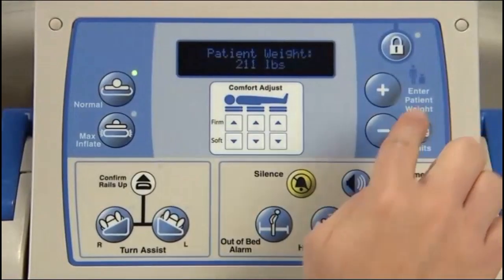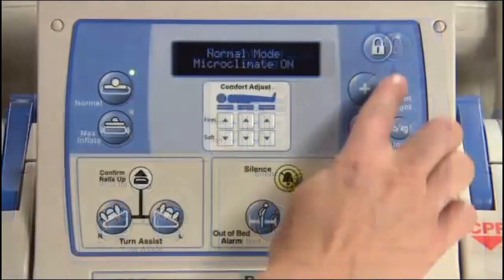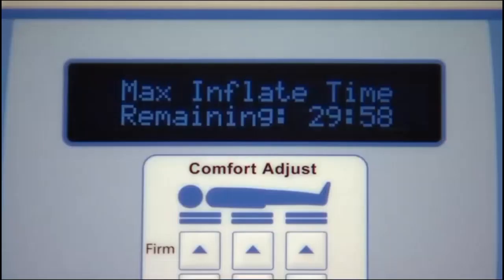Weight settings can be displayed in pounds or kilograms by pressing the pound-kilogram key. The lockout key will lock out all controls on the panel. This provides an additional level of safety. The message center displays surface functions and service modes.